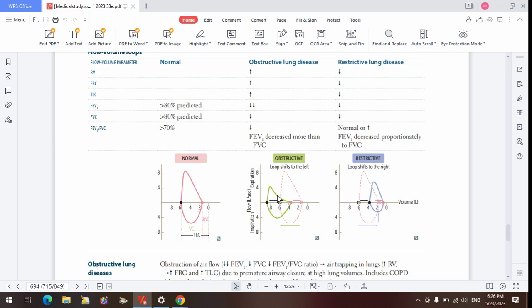It's not as steep as the usual one because of the resistance they encounter in expiration. And that slope is happening at the expiratory phase, because we've talked about the expiratory phase being the one on top. Expiration is the one happening on top. I thought this phase was labeled in the old one. They did not label it here.